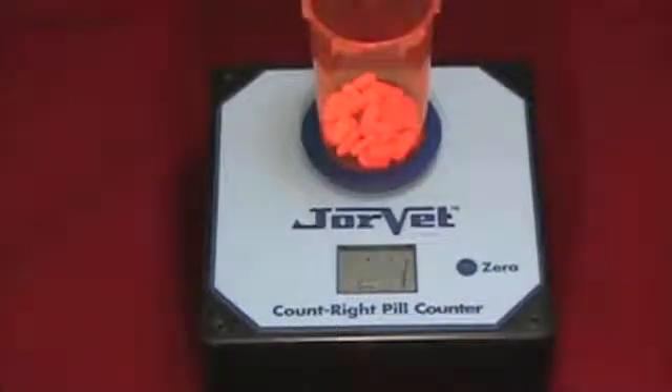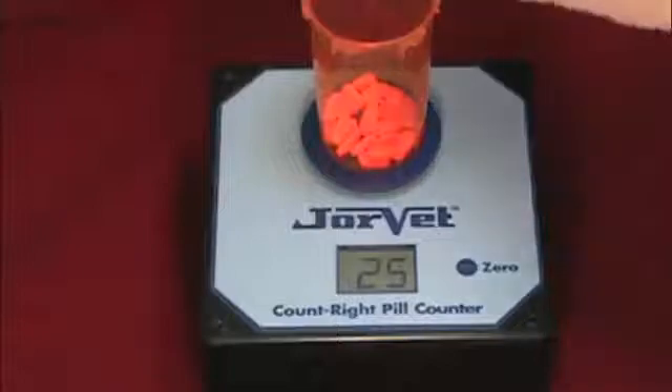Now add more pills, perhaps another ten to fifteen. The number isn't critical, but the heavier the pills you are counting, the more you can add in this first batch.